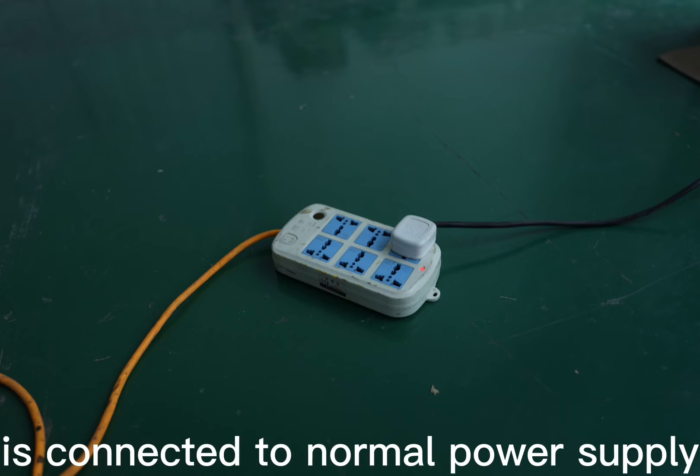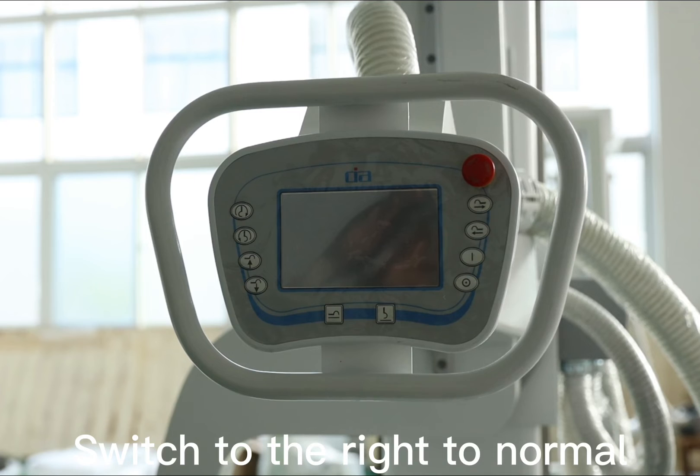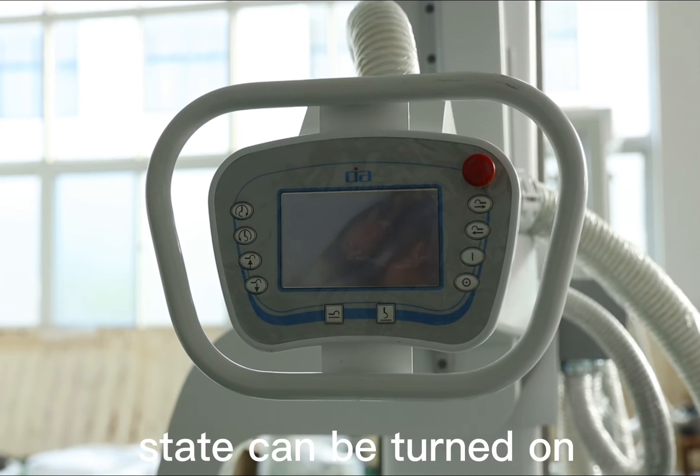Check whether the power supply is connected to normal power supply, or whether the knobs are in the normal position. Switch to the right to the normal state so it can be turned on.